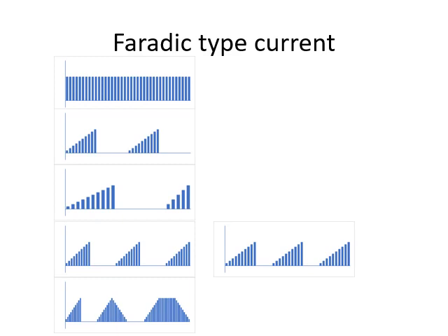In the next one, you can see the interval between these three pulses is larger as compared to the group of bursts shown in the side. The interval between the surge is less. And in the last image you can see that the one is a right angle triangle, and when such multiple right angle triangle bursts are coming in a series, it appears like a sawtooth. So this is known as sawtooth pulse.